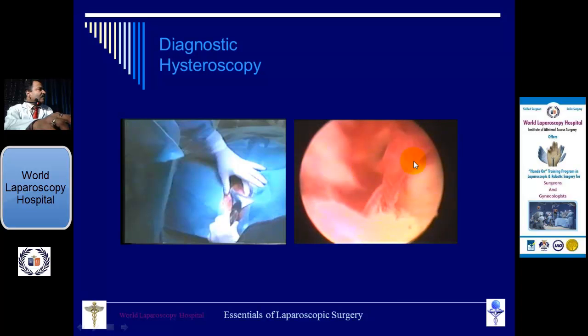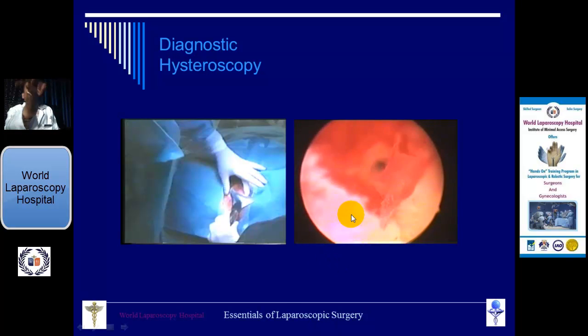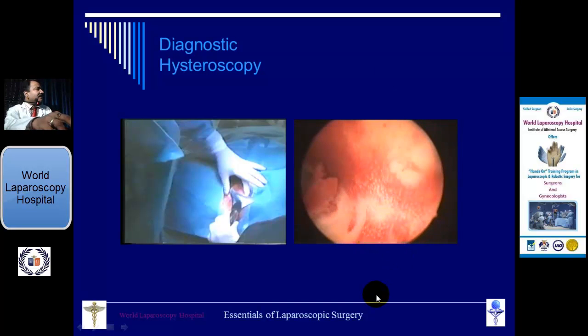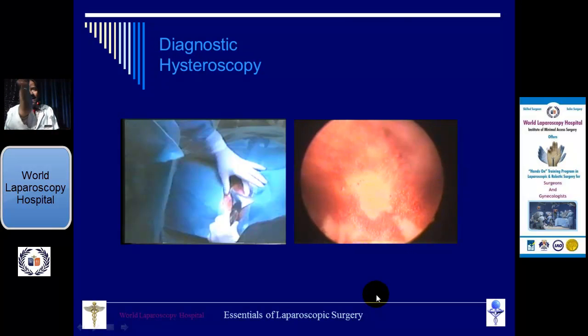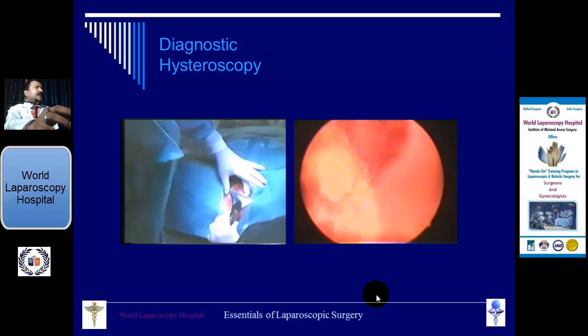These are the endometrial flakes. Sometimes beginners confuse endometrial flakes with polyps, or a blood clot with polyps. If you go very near, your magnification is huge, and that's why we confuse them. Endometrial flakes look like a flag. They move like a flag, and if you go a little away, that way they can be discriminated.